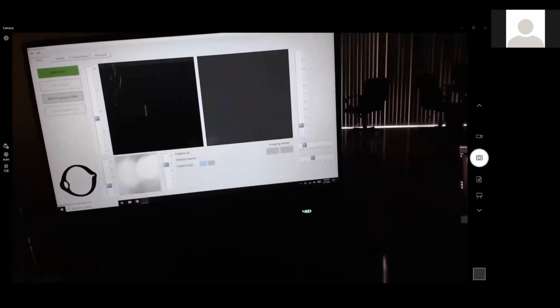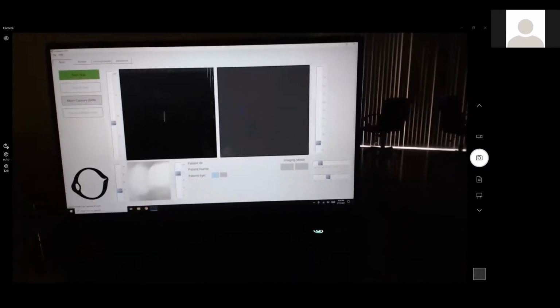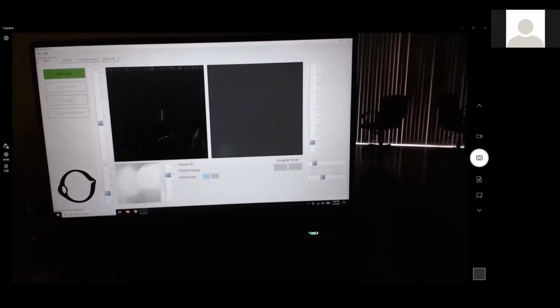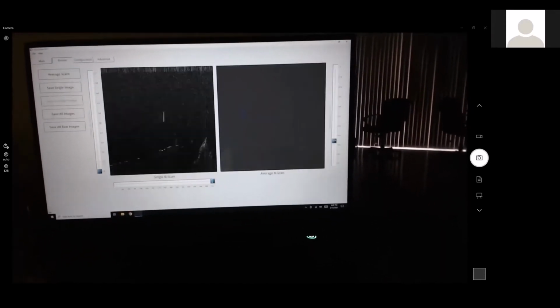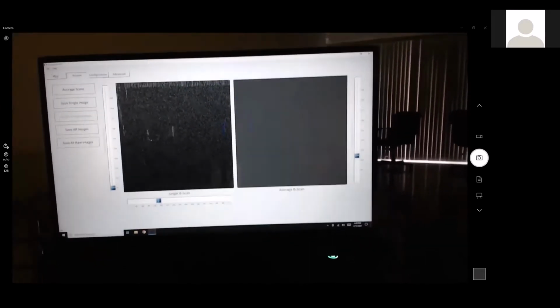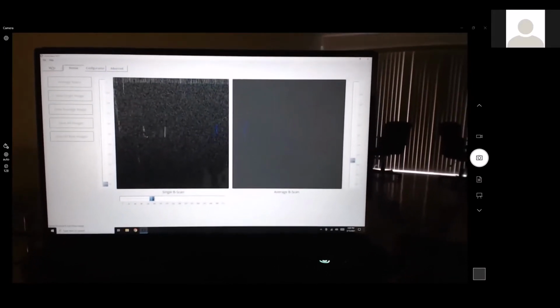There we go. So you can see this thing is scanning basically from limbus to limbus under the shot. So your right side, center, and back to the left side, you can see the hairs. And that's a very good way of capturing some OCT data. That's for the anterior.